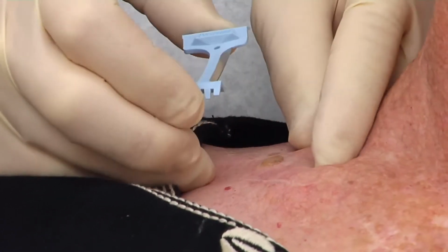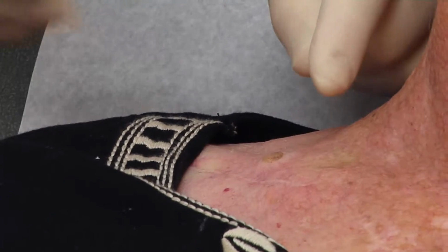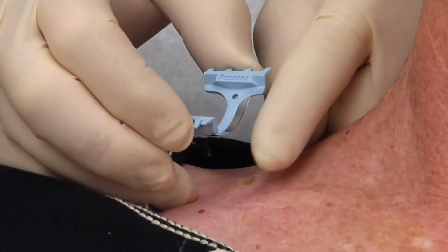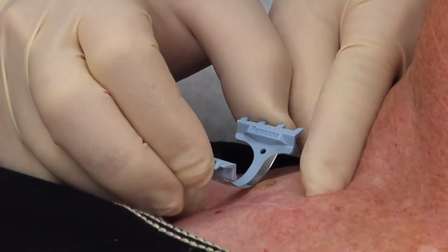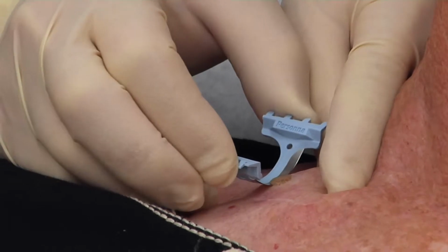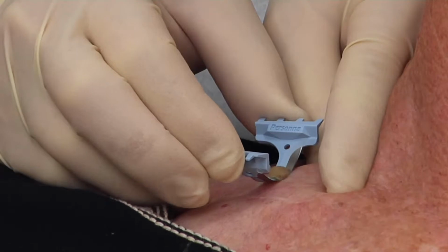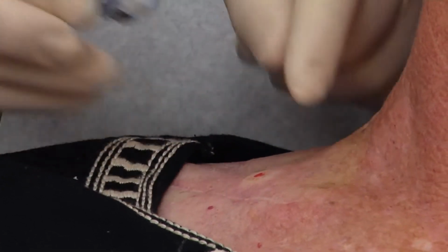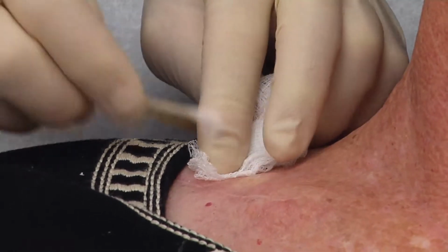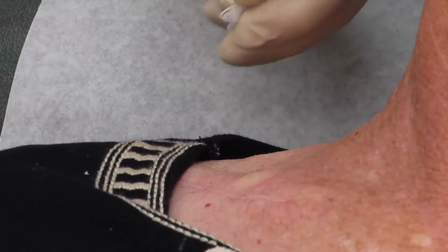And then we'll take the DermaBlade, which is an amazing tool, and we stabilize the skin around it. And I don't want to make a deep cut here, so I'm not going to flex it very much. I'm just going to flex it a little bit to get a good grip. And then, using a rocking motion back and forth, we just level it off, try and get it more or less at skin level. And that is gone. And then, just with a little bit of aluminum chloride, that should heal with hardly any trace.